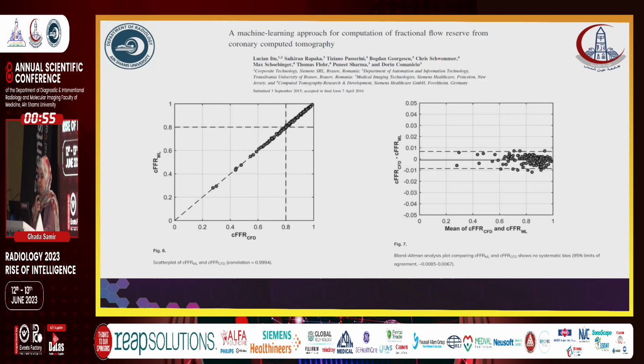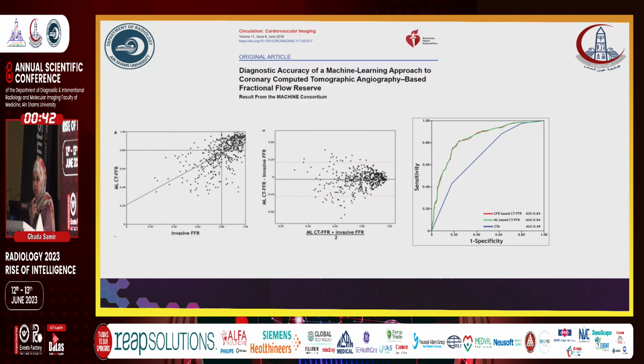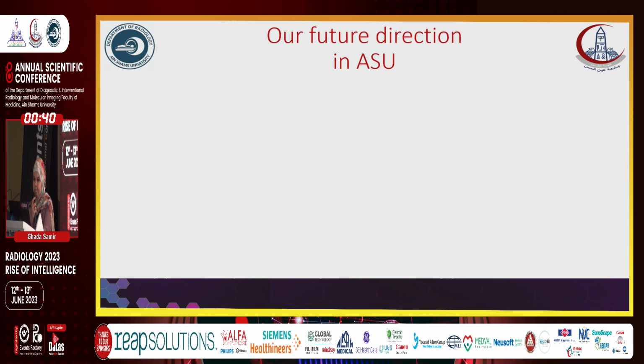Many studies have been performed regarding such CT FFR, and they found a good diagnostic accuracy of the machine learning models compared to computational fluid dynamics and also compared to invasive coronary angiography.